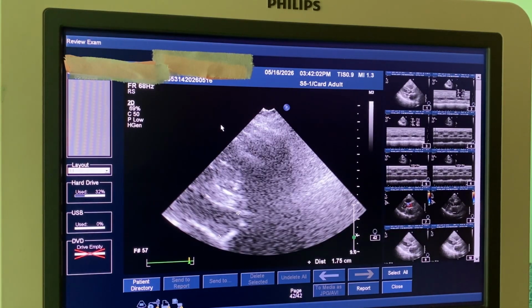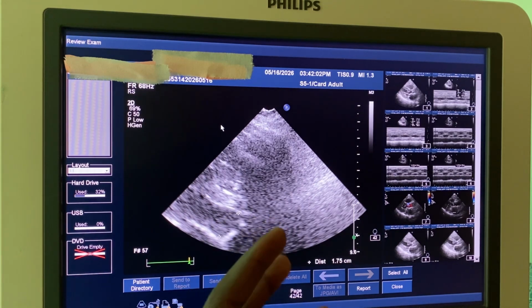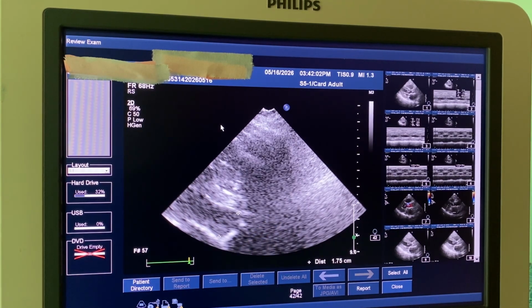But how are we going to get the stroke volume? You can write the continuity equation. We are going to make so many assumptions. Assumption 1, the ventricular outflow tract is circular. It is a circle. If you get a cross section, you find the circle. But it's not true, it's not circular.